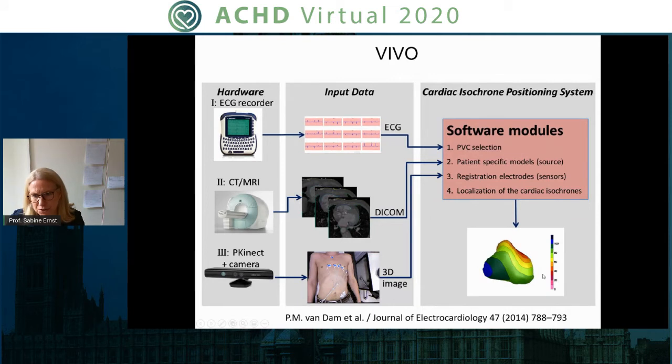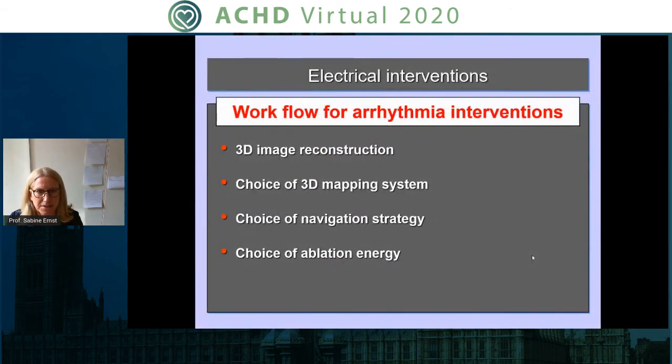It also gives you 3D reconstruction, at the moment only of the ventricles. But again, we have used this for ventricular arrhythmia in a number of patients. We are just about to start a project in congenital heart disease. We've just done a couple of index cases.